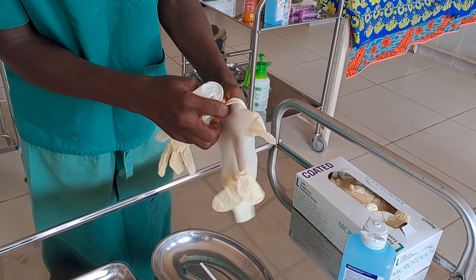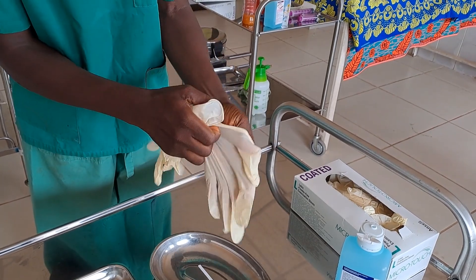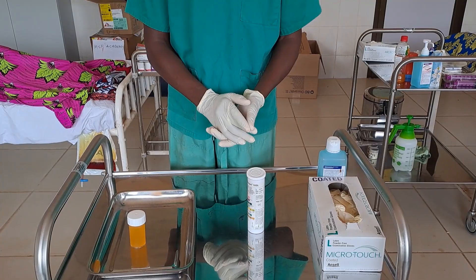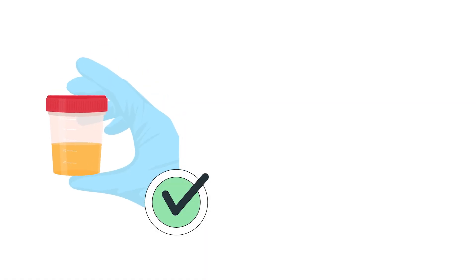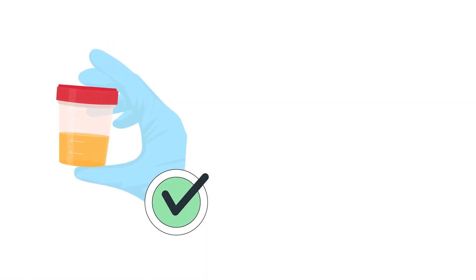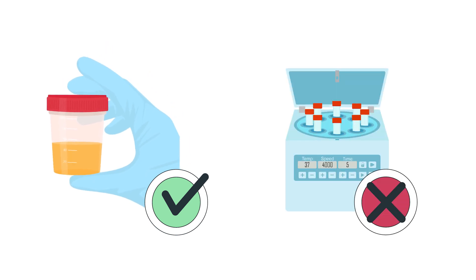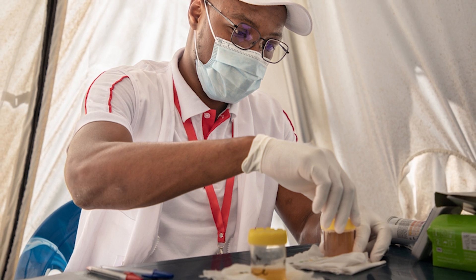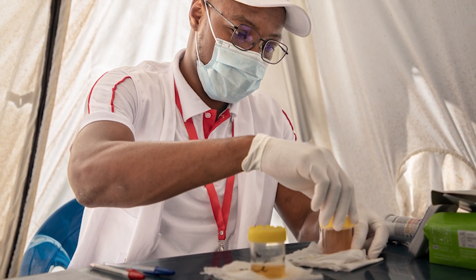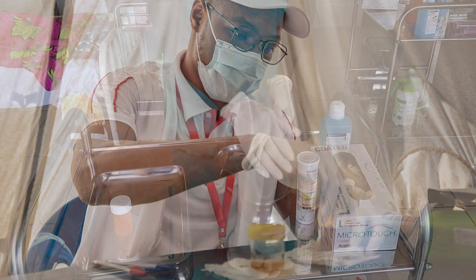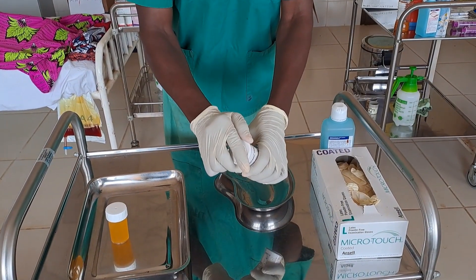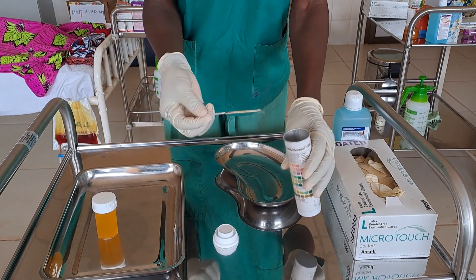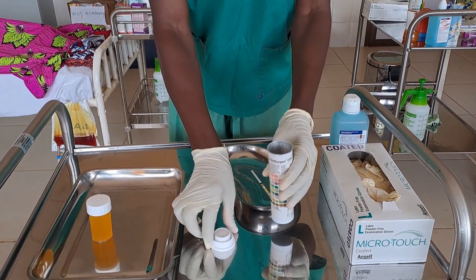Aprons prevent soiling of your uniform from splashes of body fluids; therefore, an apron could be worn. Place the sample container on a stable surface. Mix the urine sample thoroughly by shaking it to prevent layering of any sediment. Do not centrifuge the sample. Observe the colour, odour, and turbidity or aspects of the urine to document later. Remove a reagent dipstick from the container. Look to see if the dipsticks are discoloured — if yes, discard it and take another. Place the stick on the tray.